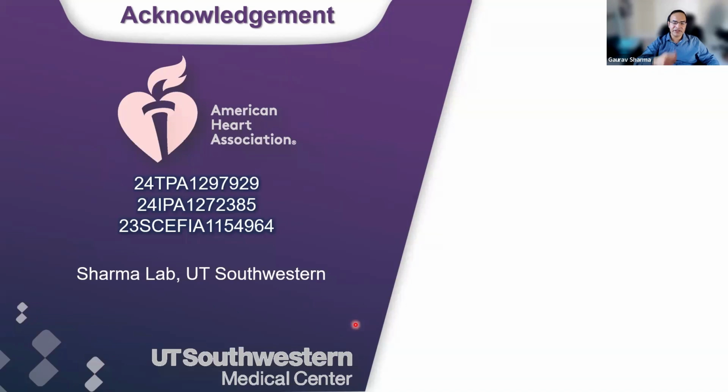For example, if you inject pyruvate, you see a dynamic signal of pyruvate from the several images. Typically, once you inject the pyruvate, you start seeing the bicarbonate and the lactate immediately.